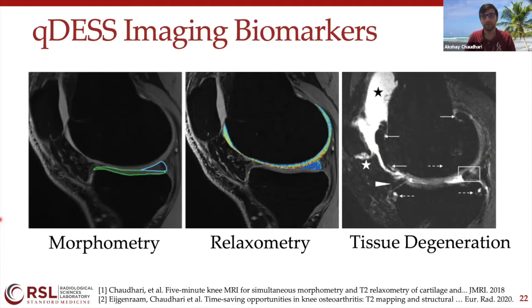Yeah, that's also another really good question. And I think this relates back to the original premise of the high signal-to-noise ratio that we need. We've been able to do a lot of validation studies that suggest that the accuracy of these T2-based measurements is high when there's adequate signal-to-noise ratio in our images. And we've very carefully studied the scan-to-scan repeatability. So for example, if I scan myself right now and then scan myself 5 minutes from now, how much does that T2 change? And we've actually shown that the coefficients of variation for this change are smaller than the coefficients of variation that one would expect to see in disease activity. So while I don't want to say that this is perfectly accurate, hopefully this is giving us a glimpse into very early changes that we otherwise wouldn't be able to see. And I think in that context, it is close to being accurate enough to answer the clinical questions that we have.